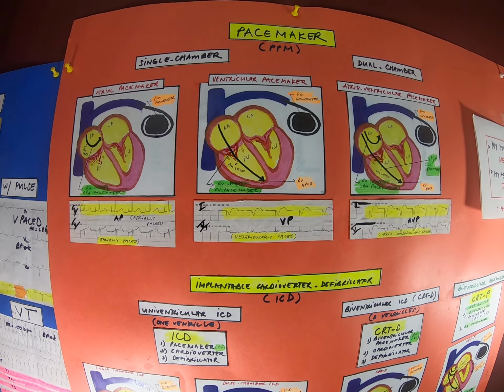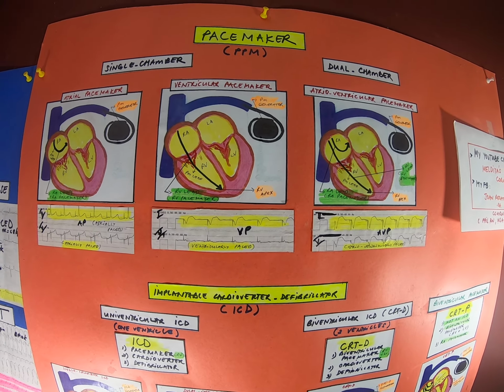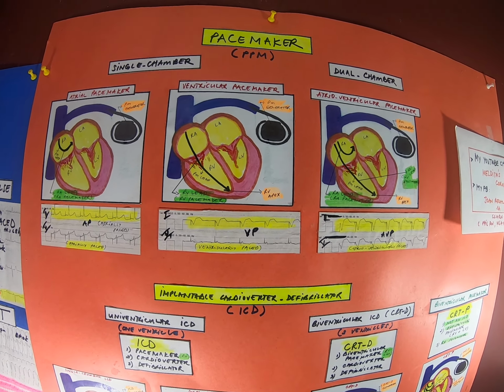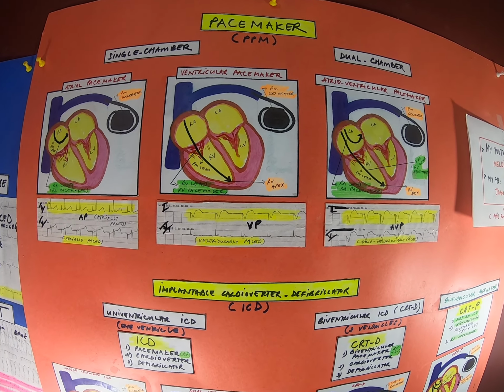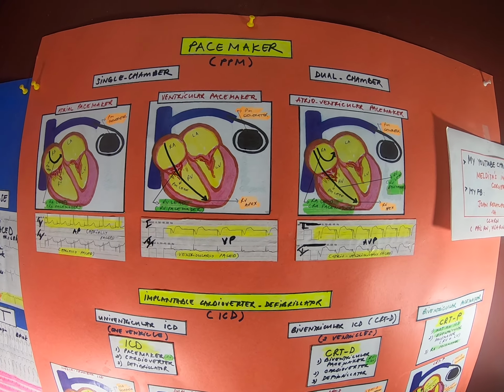Last time, I talked about ventricular tachycardia with pulse, CRTD, and V pacing. So, I will be mentioning more, or maybe just a little bit, of these devices, pacemaker and ICD, just for a little information. It's not perfect, but just to give you some enlightenment.